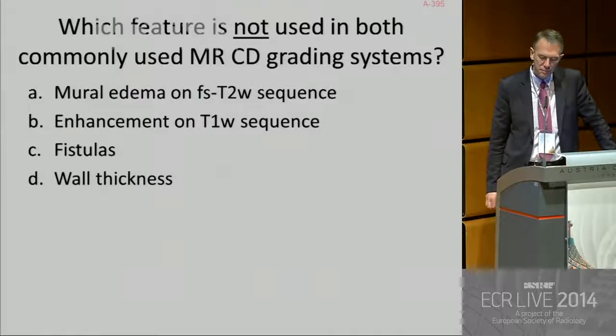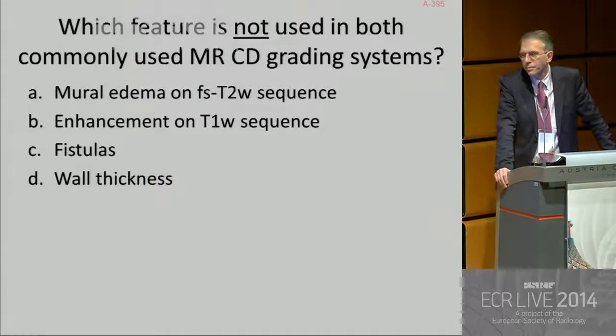So definitely describe the activity in your report to the gastroenterologist, but also, if you can, apply one of the 2 MR scores. Thank you, Jaap.